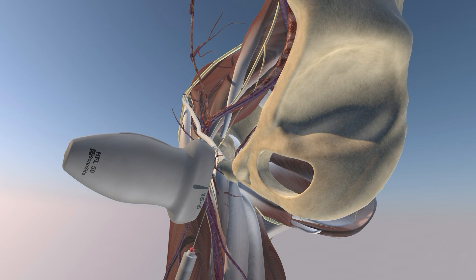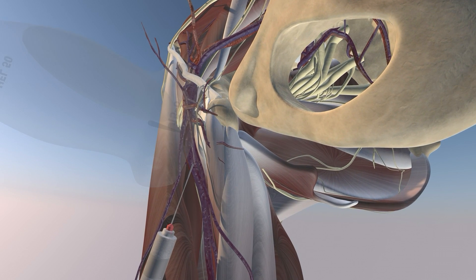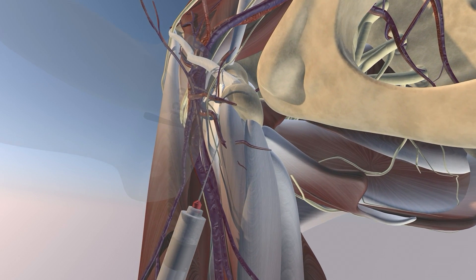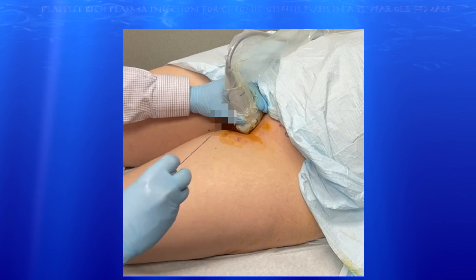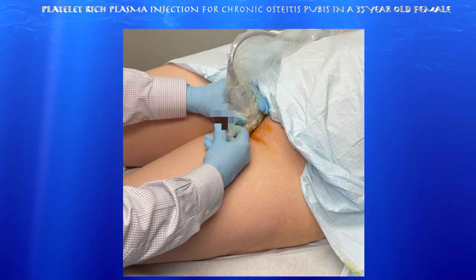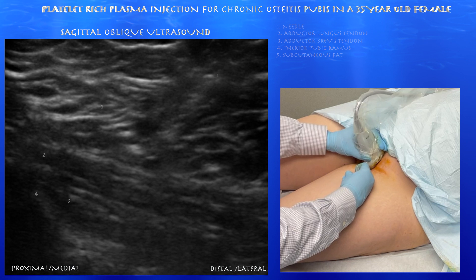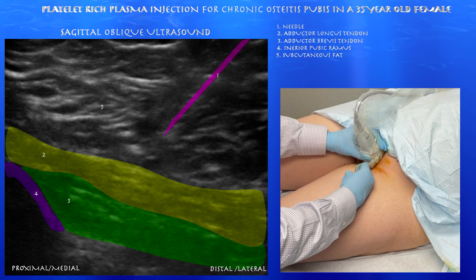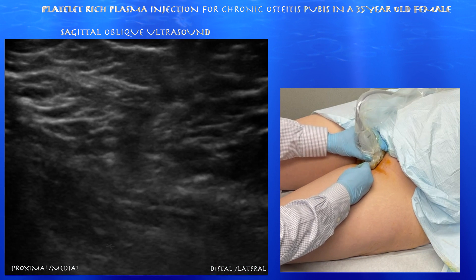We're using an in-plane approach during the injection, and we're essentially trying to get the needle at the origin of the adductor musculature — essentially at the adductor longus, perhaps a little bit of the adductor brevis tendon as well. You can see some of the injectate going superficial to the adductor longus tendon. Here you can see the needle in an in-plane approach, heading right towards the adductor longus muscle-tendon junction, with nice layering of the adductor longus muscle over the adductor brevis muscle.